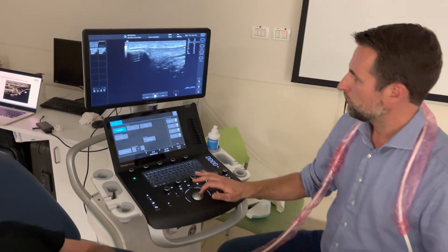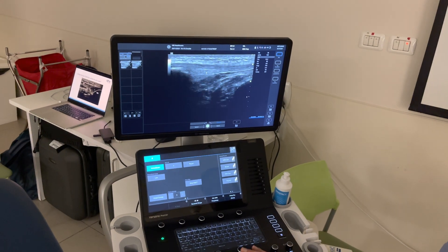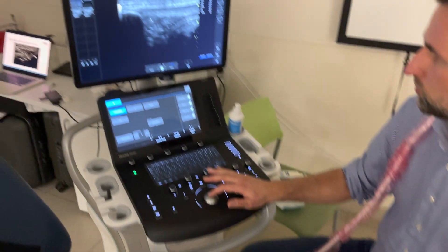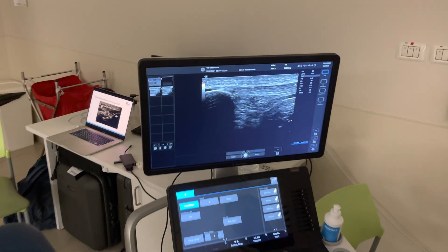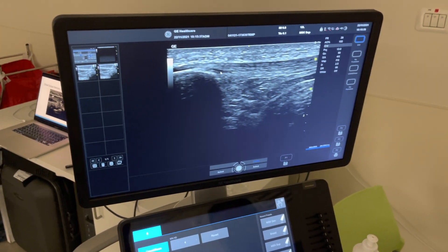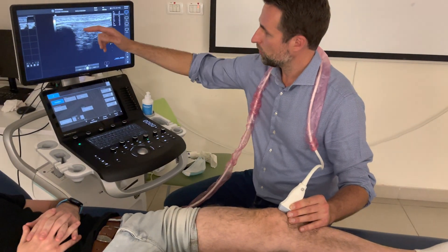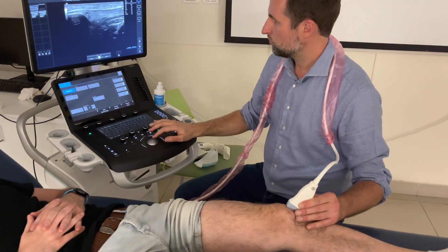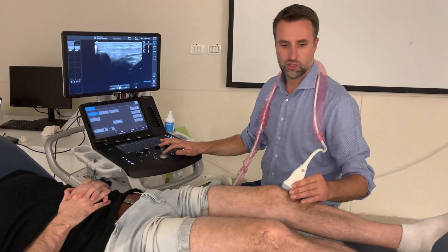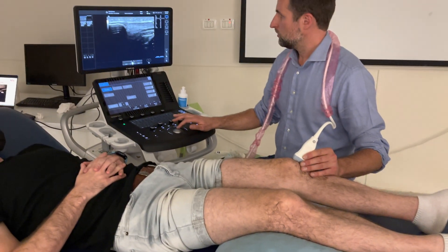Going more proximal, we end up at the distal pole of the patella, where we see the tendon attaching. Going medially and laterally, you can see a typical artifact here — a little hypoechoic area. Some people think this is actually a pathology, but this is a little bit of anisotropy from the distal fibers going into the bone. If it's dark in that area, don't always say it's directly a pathology — check the contralateral side, because you will probably see exactly the same image.